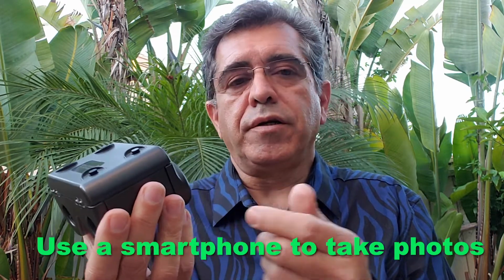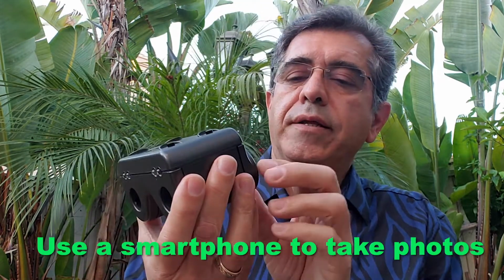One last thing that I found useful in using this device is the ability to take photos through the oculars. So I generally use my cell phone and take a quick photo of an external part of the eye, eyelids, and maybe the part of the conjunctiva or cornea.